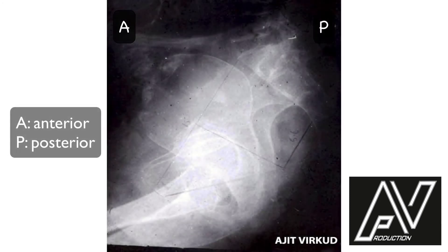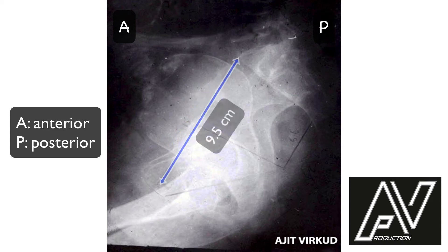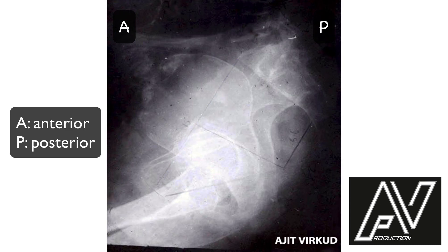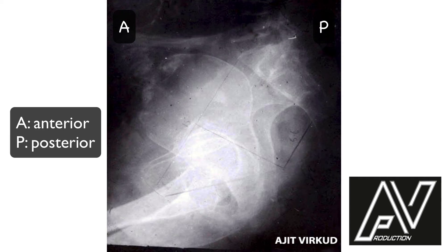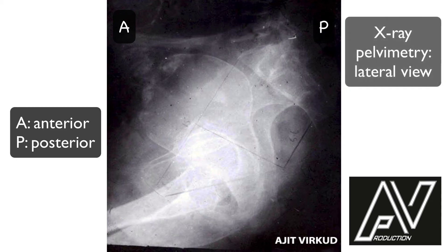This is a plain x-ray of the abdomen and pelvis, lateral view, well exposed, showing a single fetus in longitudinal lie, flexed attitude, cephalic presentation with vertex as the presenting part. The biparietal diameter has just entered the inlet, indicating that the head is engaged. The obstetric conjugate is measured at 9.5 cm and the posterior sagittal diameter of the outlet is also measured at 6.6 cm. The angle of pelvic inclination and sacral angle appear to be normal. Therefore, my diagnosis is lateral view of x-ray pelvimetry.